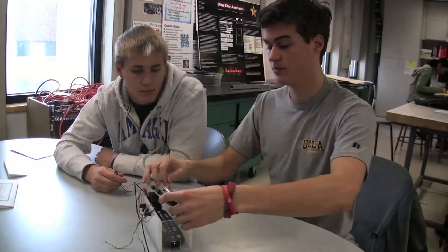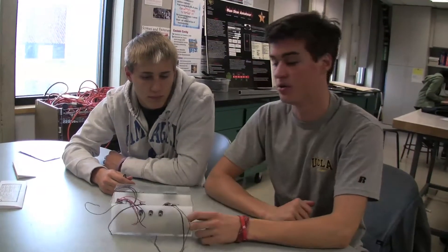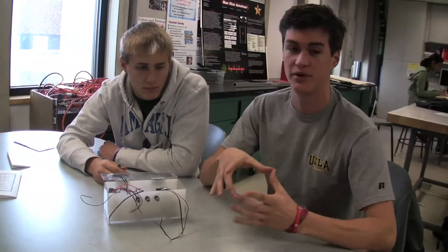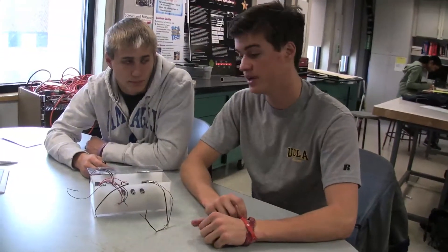Our client that we built this for lives in the 19th Street homes. She's in a wheelchair and has basic motor skills, so she wouldn't be able to press little buttons on a remote. We made big, like three-inch buttons and they're color coded. She'll be able to slap the button to turn on the functions and make it work for her, so it's pretty easy.